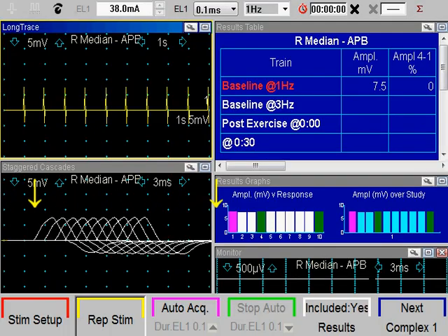The amplitude of the fourth CMAP, indicated by the green bar, is compared with the first one, and in this recording there was no change, and therefore the amplitude decrement is 0. The system can also calculate decrement for the last stimulus, the 10th one, and that's why it is shown in green color. However, we have elected not to show that result in this default configuration.